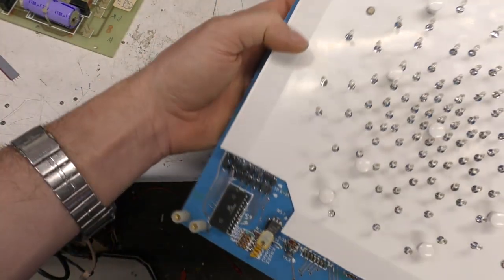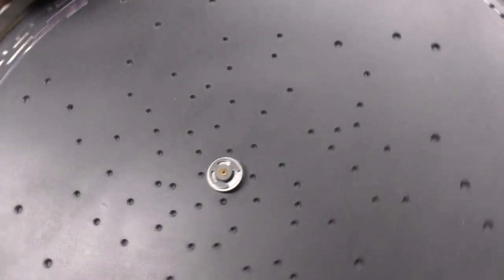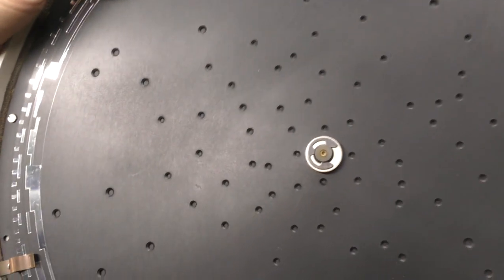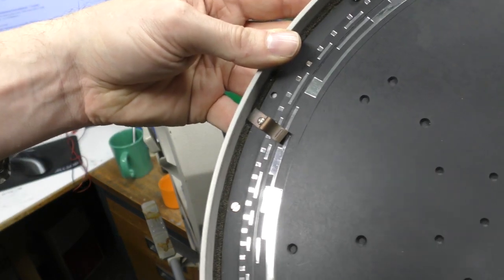Nothing else particularly exciting going on here. If I take the front off this, this bit comes loose. So this is one of the two discs that display the patterns as we change this. You can see different holes. There's two discs with separate sets of holes, designed to line up to give each pattern. And then we've got an optical encoder here to tell the LEDs which pattern is selected at any given time.